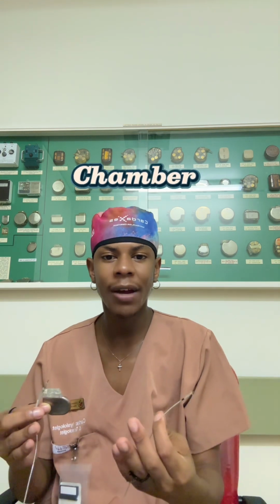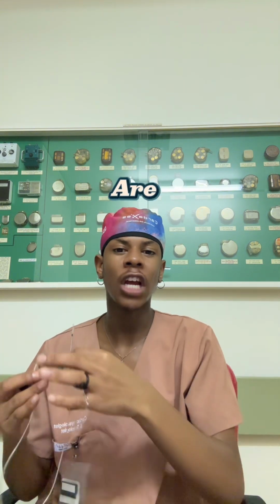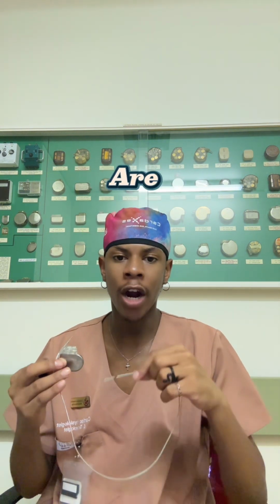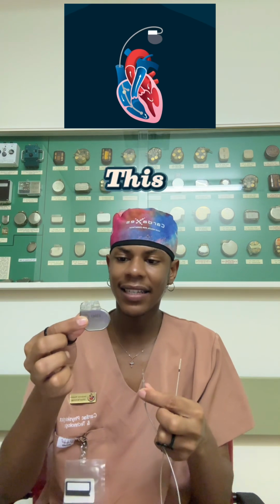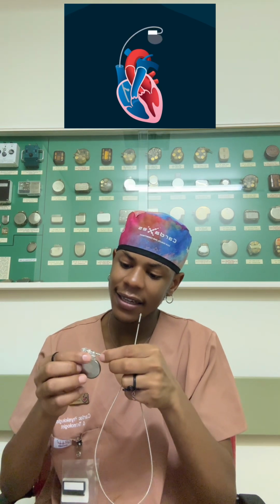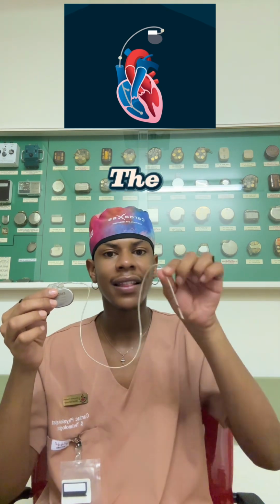So we have single chamber pacemakers, which have only one lead. It can either go to your atria, which are the top chambers of the heart, or the ventricles, which are the bottom chambers of your heart. The cardiologist implants this usually in the left or right pectoral fold, but before this is implanted, they start with a lead. The lead is threaded down the vessel.